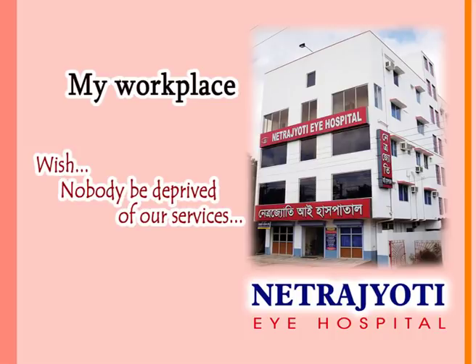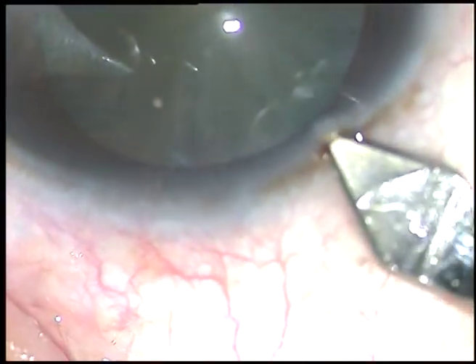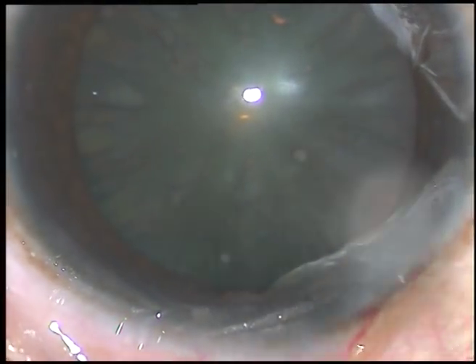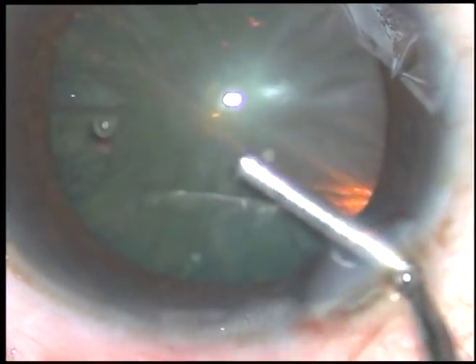In this video I want to show my lens tilt technique. The main incision is being placed at a selected site. A viscoelastic substance is injected into the anterior chamber — this is 2% hydroxypropyl methyl cellulose.